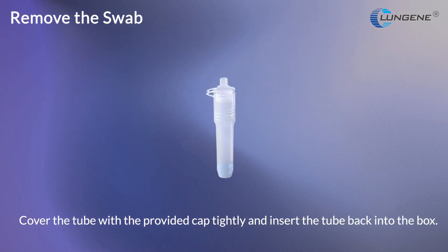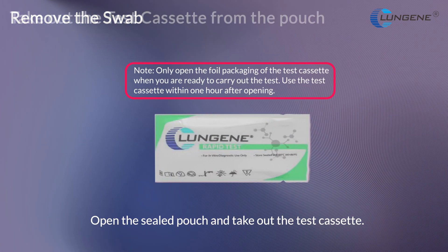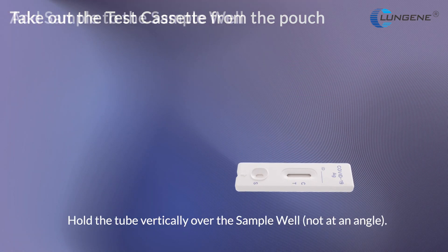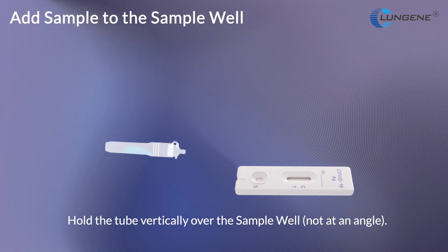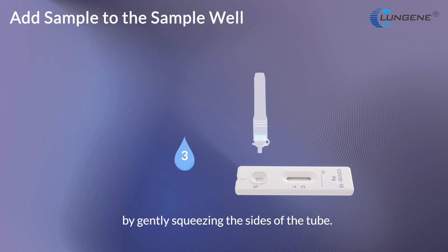Cover the tube with the provided cap tightly and insert the tube back into the box. Open the sealed pouch and take out the test cassette. Hold the tube vertically over the sample well, not at an angle, and add 3 drops from the tube into the sample well by gently squeezing the sides of the tube.